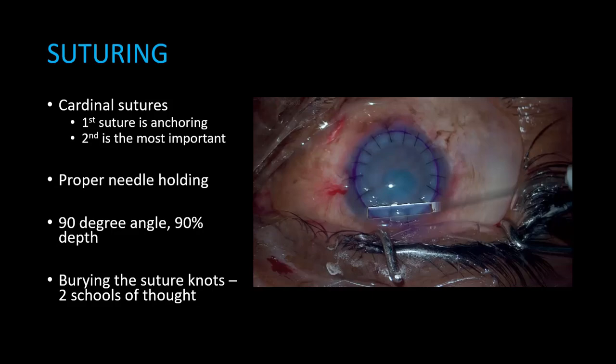So, beyond that, there are two things that are most important that you need to keep in mind. You completely remove the infective foci, because otherwise that would defeat the purpose of doing a therapeutic keratoplasty, and make sure your anterior chamber is completely formed. The angles are open by the end of your surgery. Otherwise, of course, there's a very high risk of developing secondary glaucoma, and the prognosis of this eye is not going to be that great.